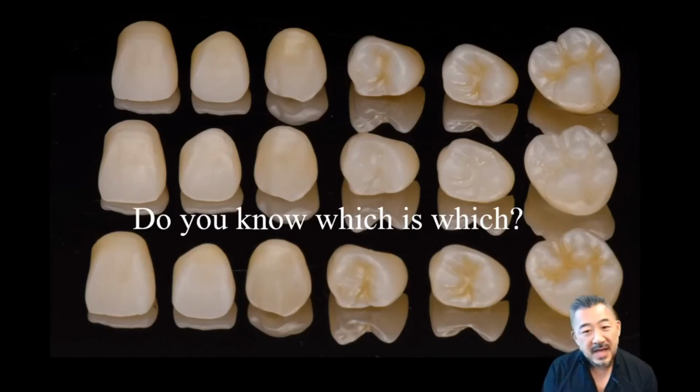Well, unfortunately I can't hear you, so I'll answer. The answer is: the top is zirconia painted with artist stain as I showed before. The middle is zirconia with no stain applied to the TT multilayer disc, and the bottom is zirconia painted with only O1 and O2 on the TT multilayer disc. You know?